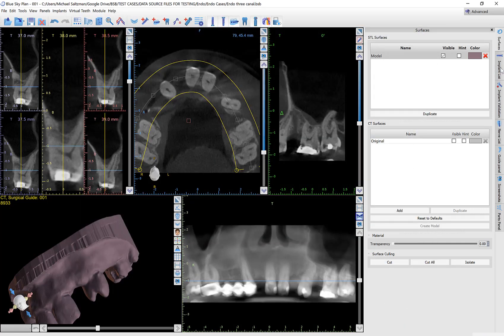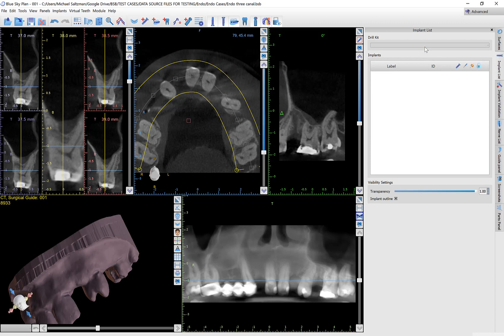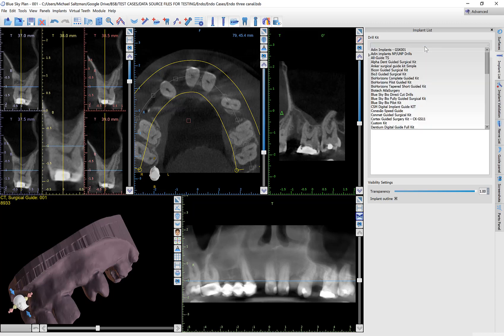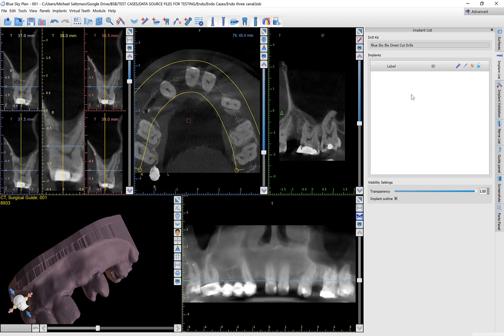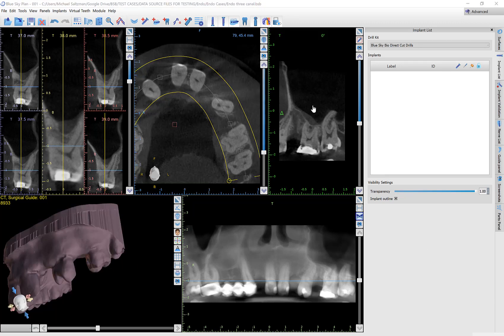On the implant list, go ahead and select the Blue Sky Bio Direct Cut Drills. This will allow the software to automatically control the depth once we enter the drill length, which we'll do in a little bit.